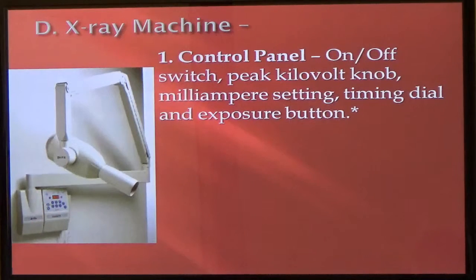You're going to set the time, set the intensity of the beam, set the kilovolts and the milliamps so that you have the proper X-ray exposure.